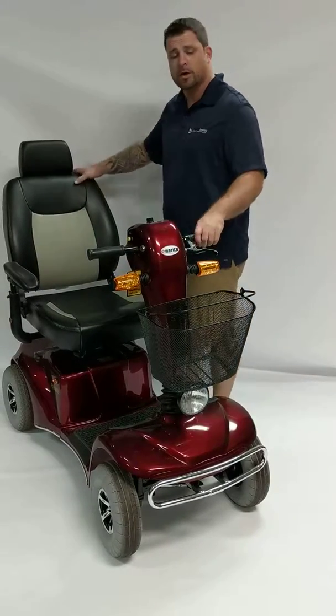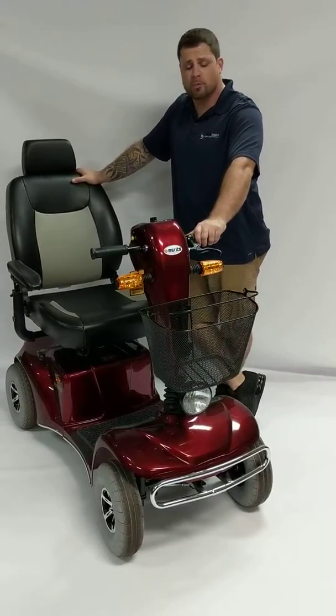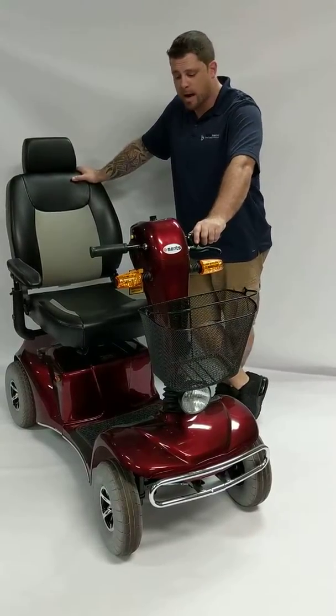This is a heavy-duty scooter. It's got a 500-pound weight capacity. It goes 32 miles per charge at a maximum of 6 miles per hour.